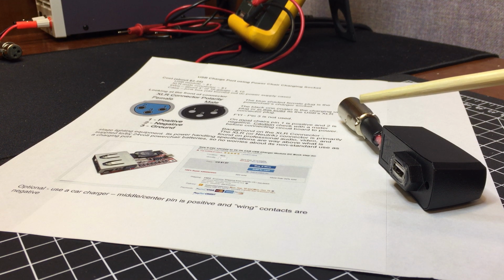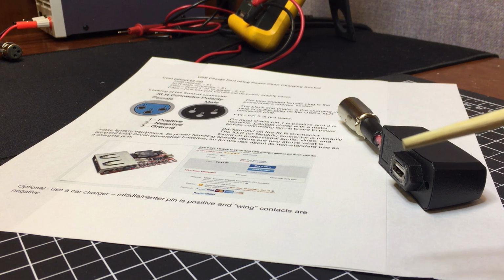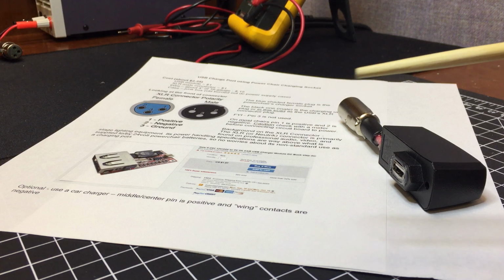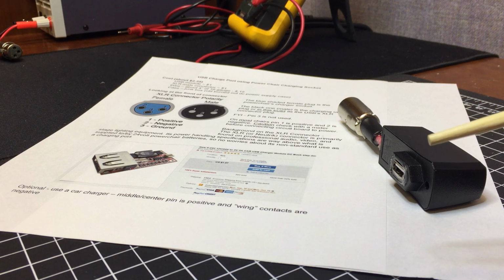connector that is on typical power chairs. There's the module. You can see it in there, a module for USB, and you can get that on eBay. I'll show you this sheet here in a second. This is just an old case from a burned out DC power supply. You can use any case you want.